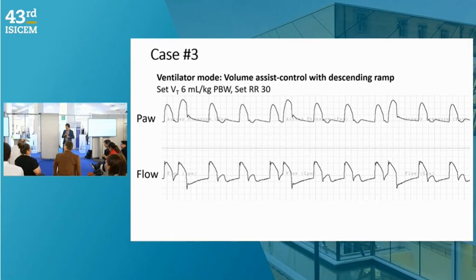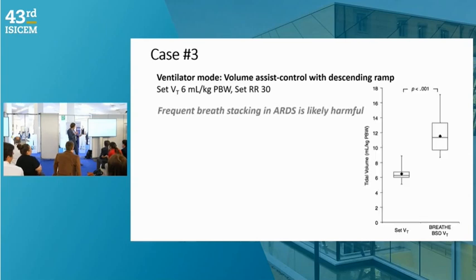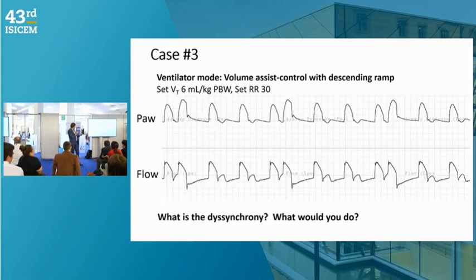All right. We could do this last one really quickly, I guess, just because it's fun. So this is a patient with some sort of dysynchrony, which people love to get called to the bedside for. The classic patient is fighting the ventilator. So this is an example of breath stacking dysynchrony, which is defined as 2 machine inspiratory cycles without exhaling all the way between them, right?